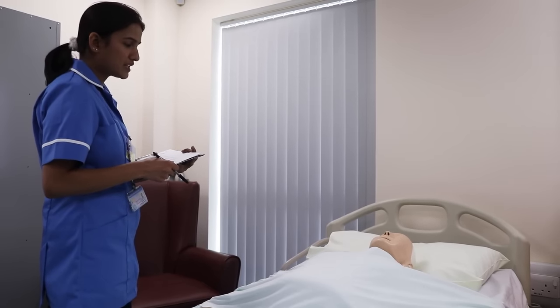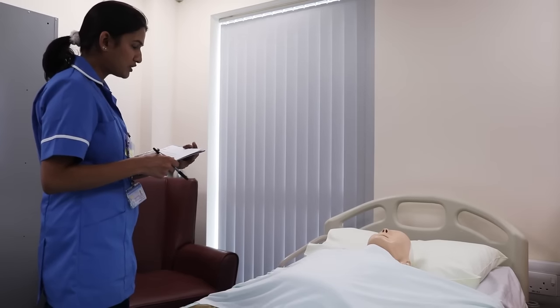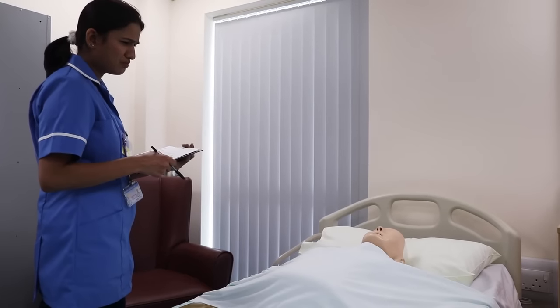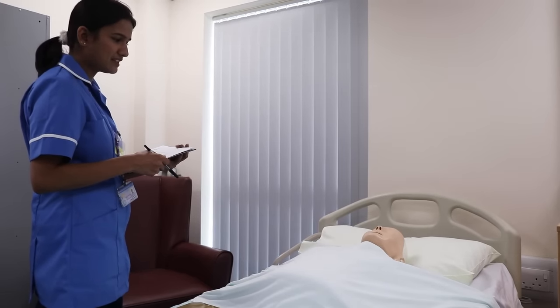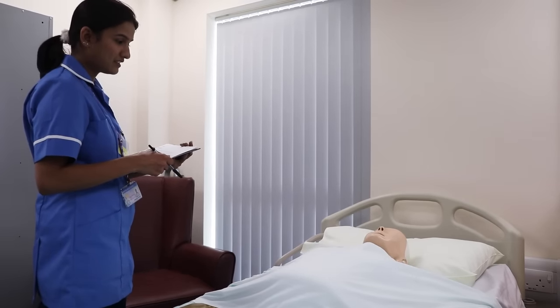Do you know why you are getting this medication? It helps with the voices. That's perfect, yeah. John, are you happy to take the medication right now? Yes, that's fine. Okay, and do you have any allergies to plaster or latex? No. Any other allergies? Not at all, no. Okay, and where would you like to take this medication? Last time they gave it on my right.